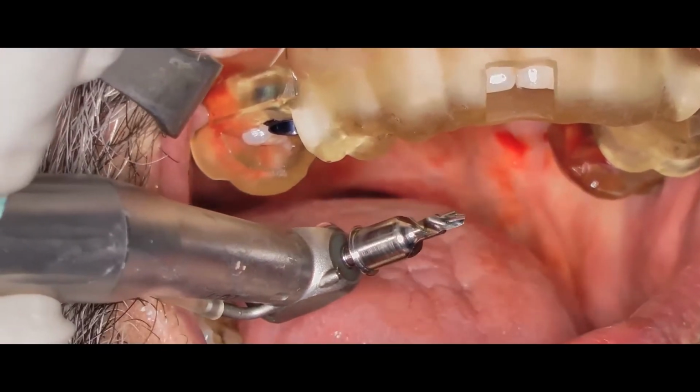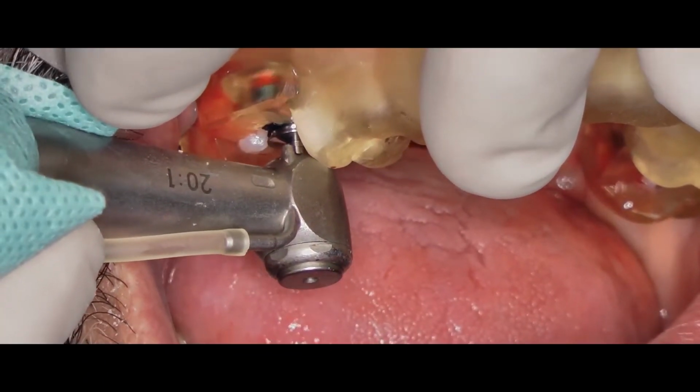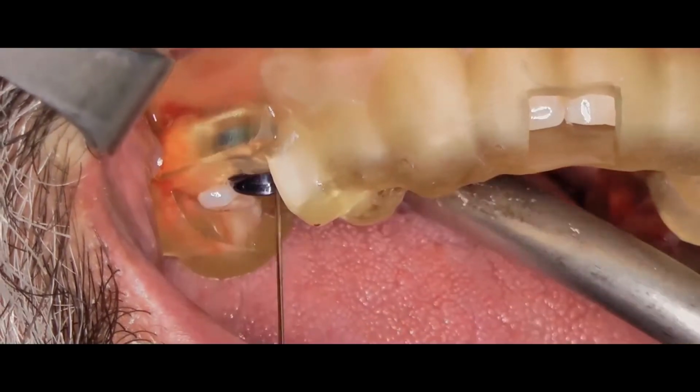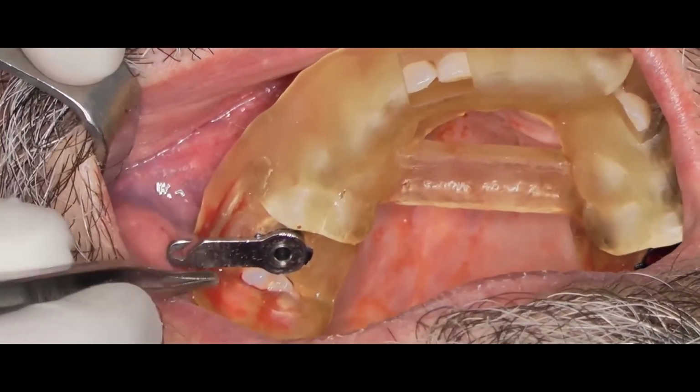We irrigate inside the canal between burrs every time. We then proceed with this 5mm in length burr. This is because we need to ensure contact at all times between the guide tube and the bone. It also helps to create vertical space for the subsequent burr since we are working on the posterior side of the mouth. The inner sleeve is required to use the 2mm drill.